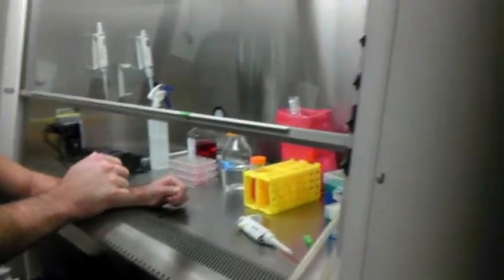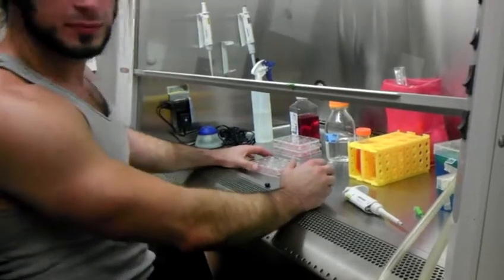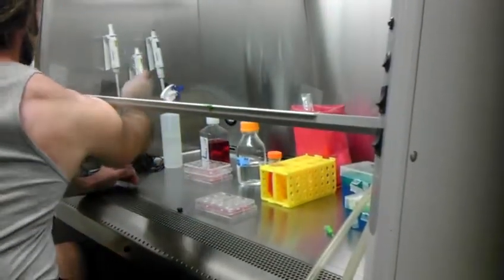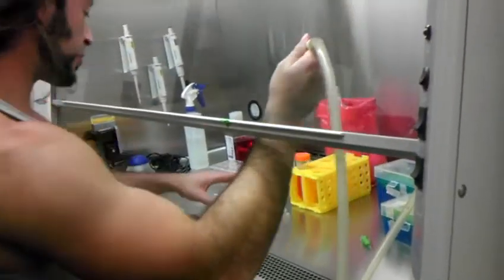Alright, so now we need cells. This is where we need to start. We need to aspirate the old media, and hang this back up? Yep. Aspirate the media off all the plates, and then we're going to wash it with PBS again. So we pull all the media out of this? Yep.